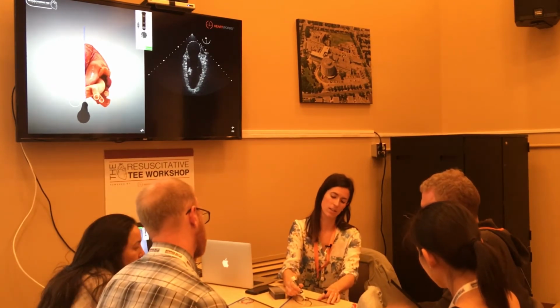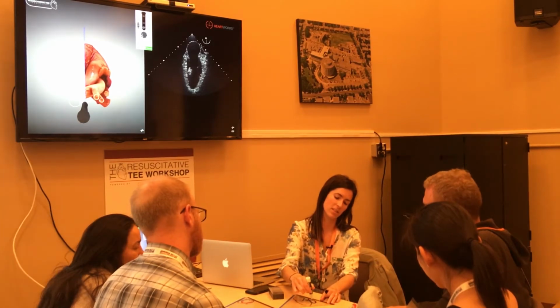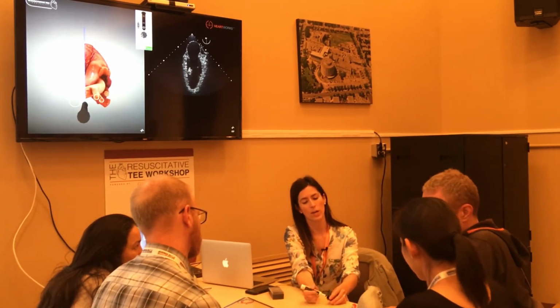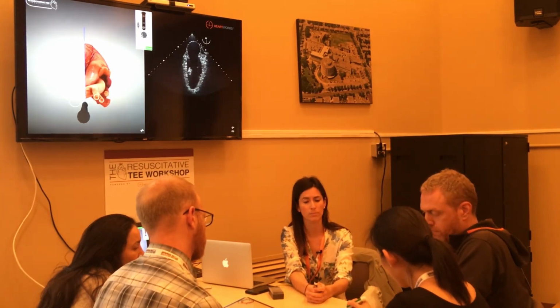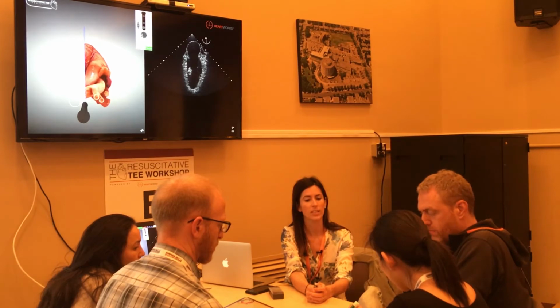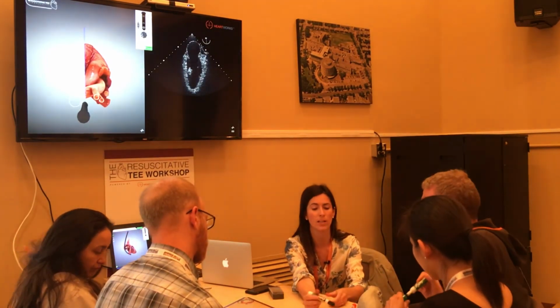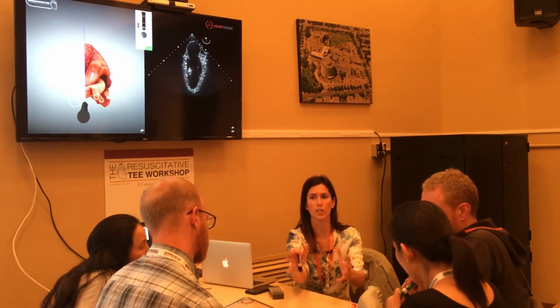I'll add a little aortic valve and something here. This is the RV. So tell me now, where is the anterior wall and where is the inferior wall? Anterior is still going to be here. Yes, exactly. And now we've added a septum, so anterior septal and inferior lateral.